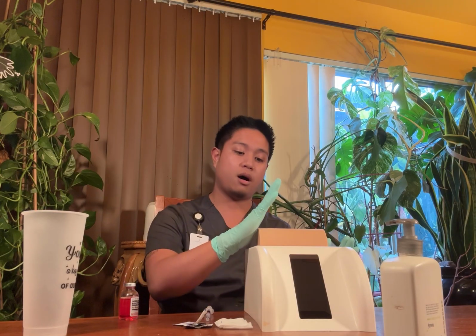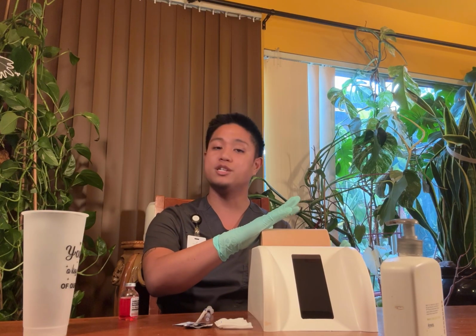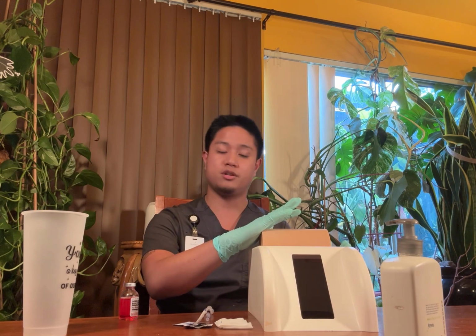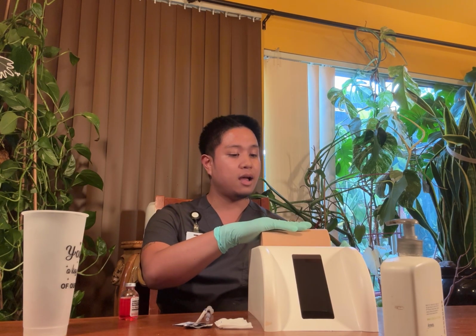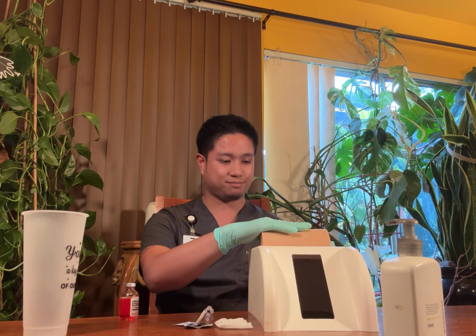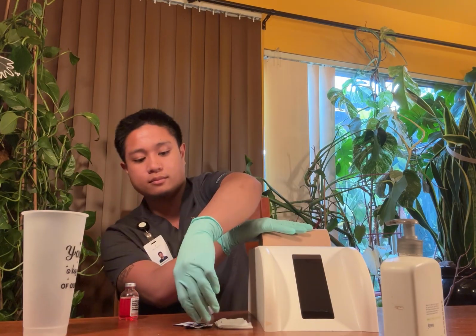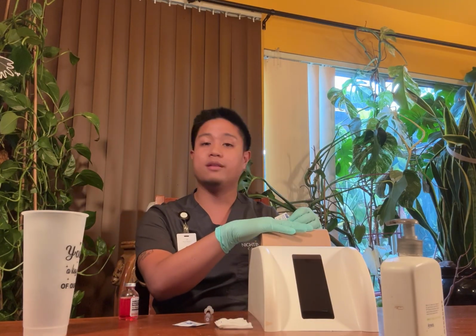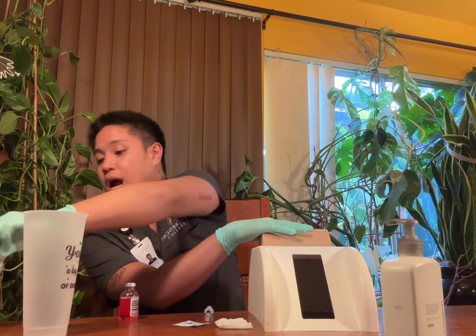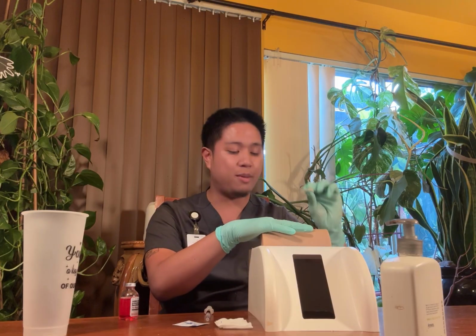So I'm going to place my palm on the area near the greater trochanter, and I'll point the thumb towards the groin, and then I will use my pointer finger to be placed on top of the anterior superior iliac spine. Then my middle finger will be placed on top of the iliac crest. With the V shape that I made with my pointer and middle finger is where I will administer the medication. So I'm going to grab the alcohol pad.